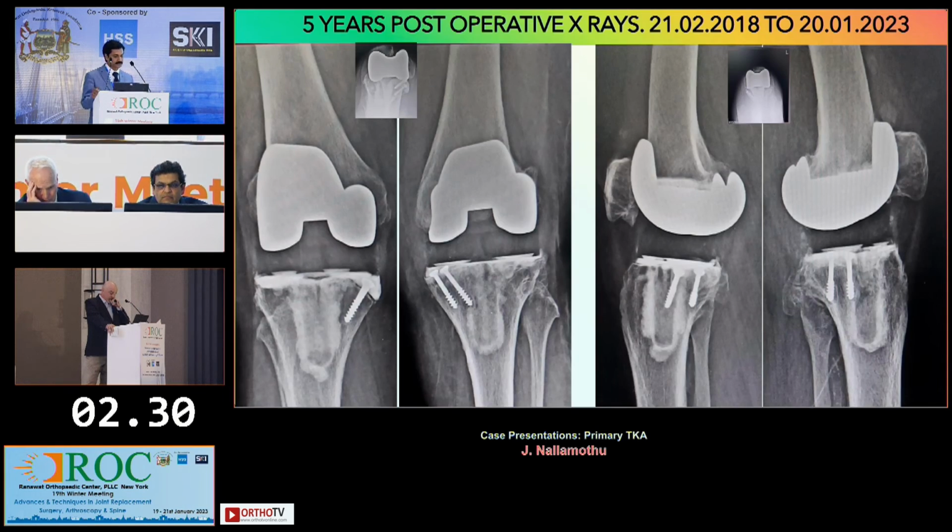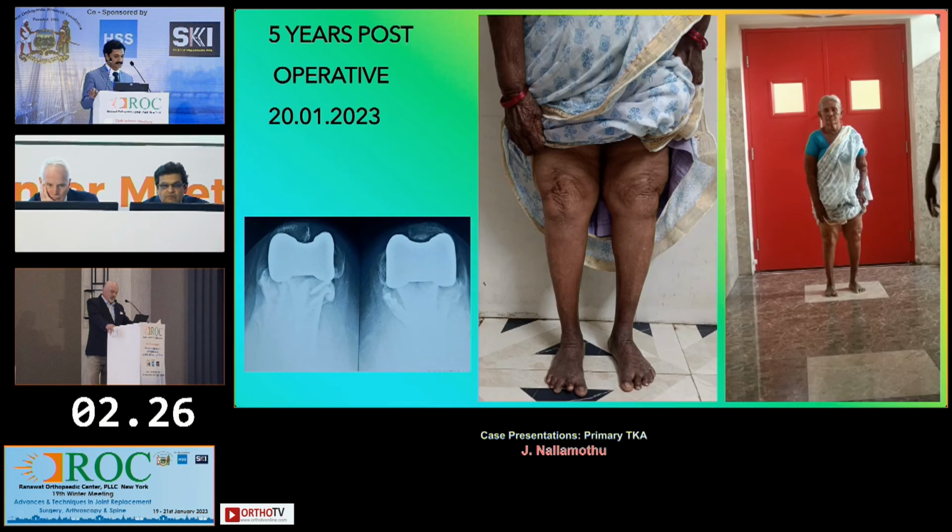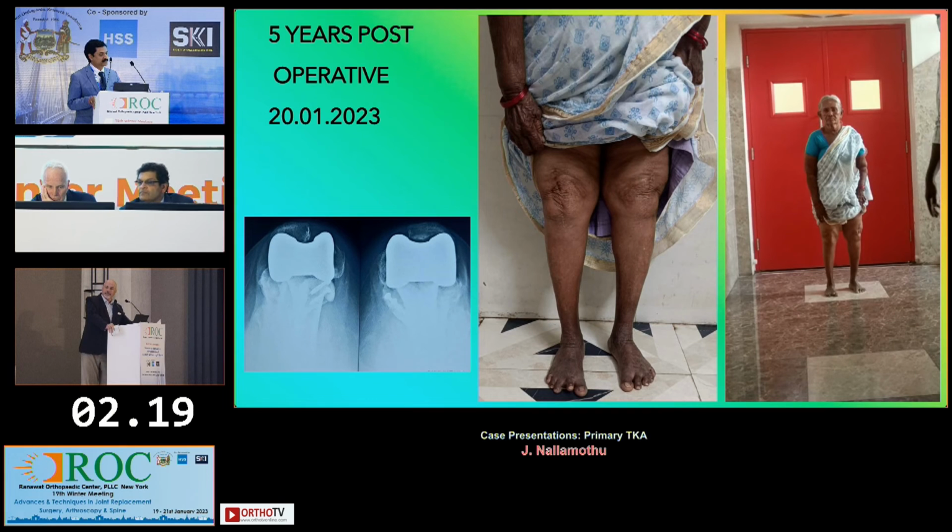And why didn't you do the patella? Oh, I have not done the patella. Is that your routine? No, it's tracking. In those days I was not resurfacing the patella. Now I resurface every patella.